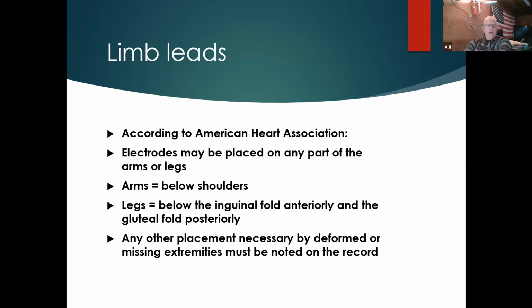So remember, you're going to go down south on the leg. So below the inguinal fold, you're going to get down onto the hamstrings or the quadriceps, big muscles, right? Go down low onto the calves. Why do we tend to go to the calves and the ankles? Because it's easier access. We do live in central New York, people, and you may live in Georgia. It gets cold in the wintertime.